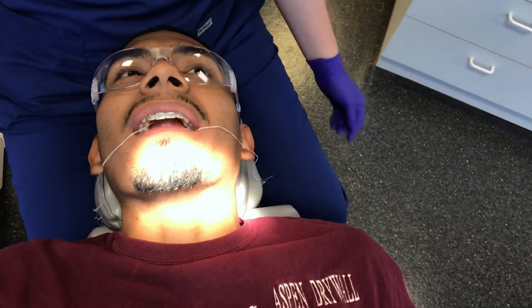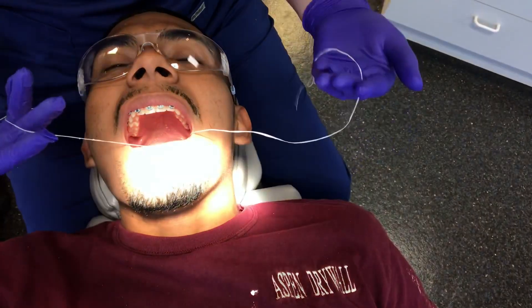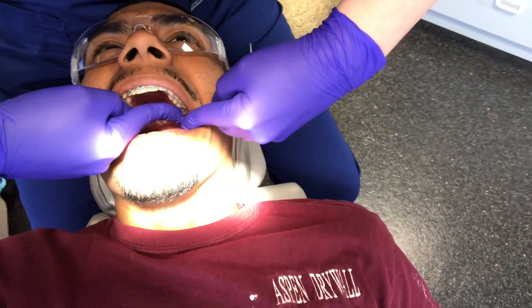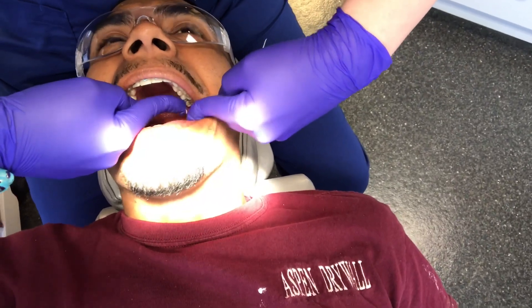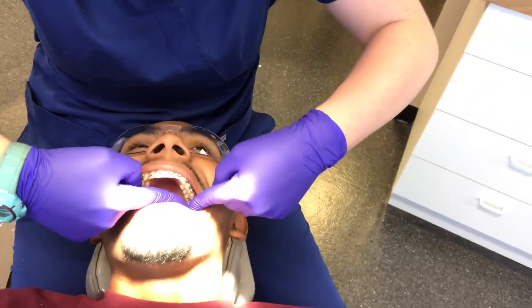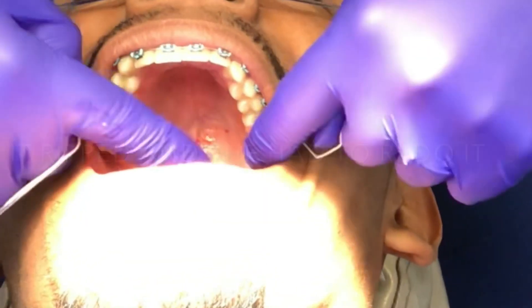Oh my God. Yeah, it kind of sucks. So now I'm going to relieve that pressure. I'm going to wiggle it a little. You're going to feel me wiggle the separator a little bit. And this is why I did the filling tooth first because they're always the toughest. I don't enjoy torturing you, if it makes you feel better. This is not my favorite thing to do. Oh, broke my separator. That's okay.